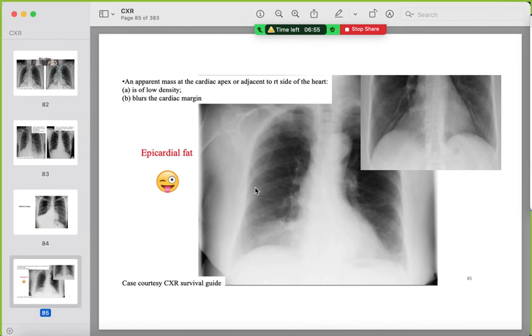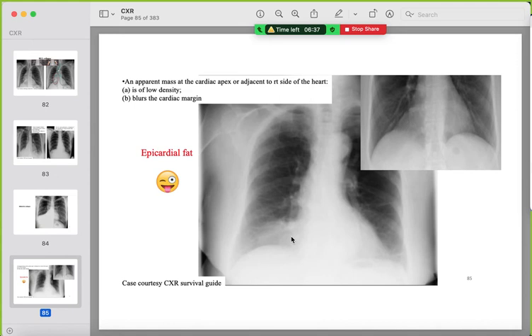A mimicker for right lower lobe opacification is epicardial fat. The density appears grayish rather than white like a true collapse. Train your eye to recognize this fat density and avoid confusing it with right lower lobe pathology.